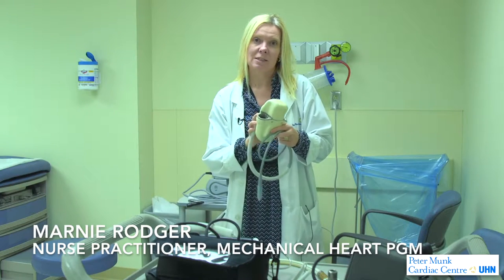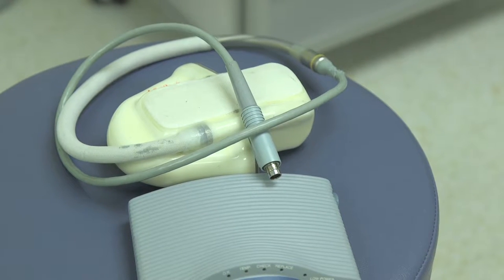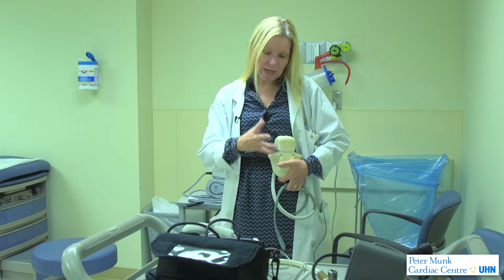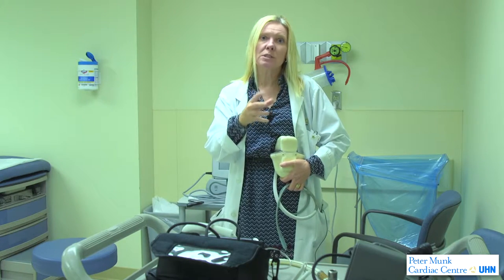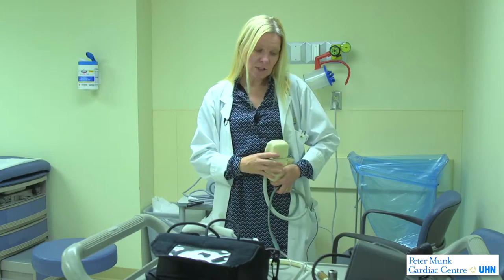When our program began in 2001, we used to insert Left Ventricular Assist Devices called LVADs. This was the original NovaCore — a big blood pump that the surgeon placed inside the patient's body and attached to the patient's heart. It had a pusher plate that pulsed, and the blood would go into the pump and then back to the patient's body. You could actually hear this pump if the patient was standing in the room with us.